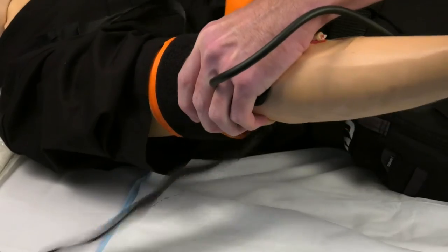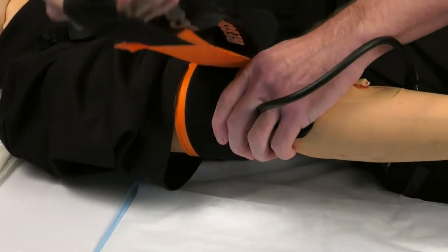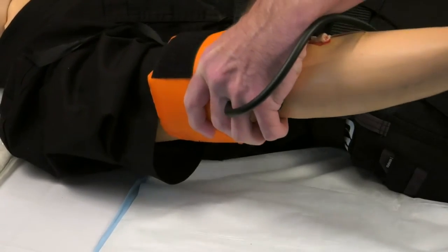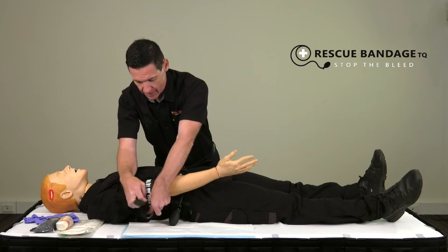Make sure that the bandage is firm and continue until the velcro comes in contact with the bandage, then secure and fasten.